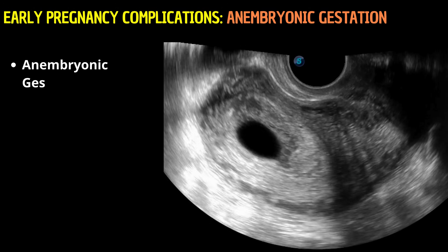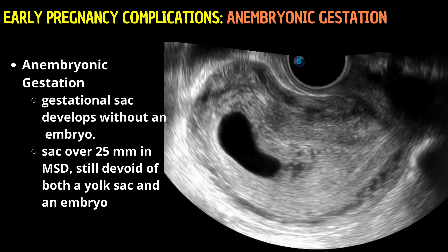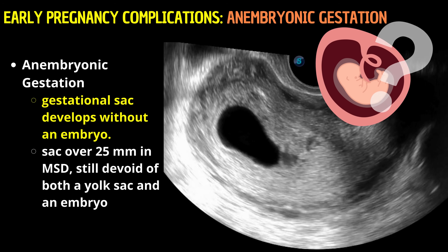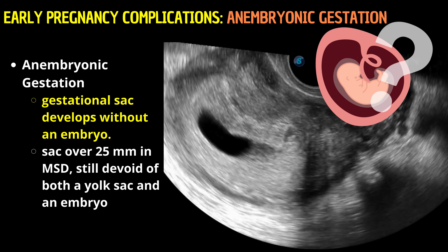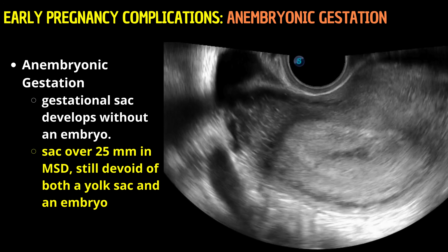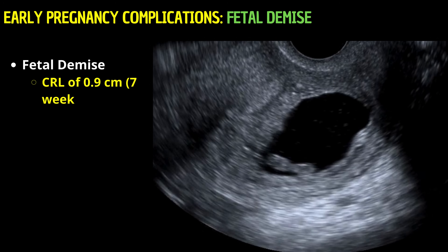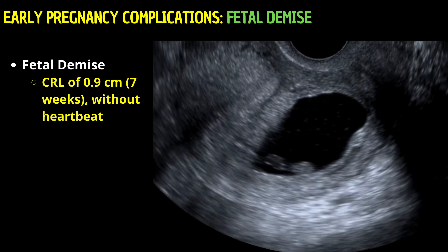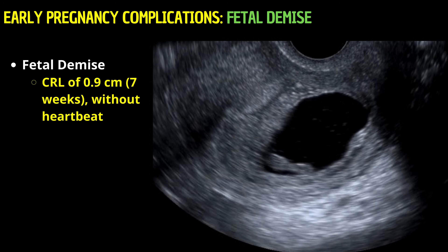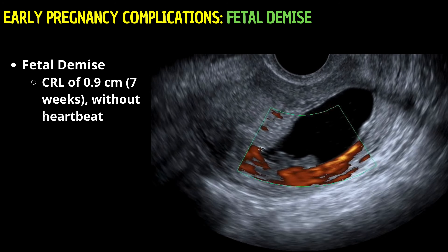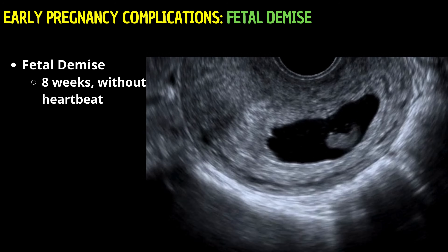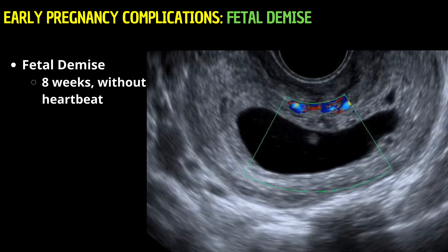In early pregnancy assessments, we sometimes detect the absence of crucial developmental milestones, such as in an anembryonic gestation or blighted ovum. This condition is characterized by the development of a gestational sac without an embryo, identified when a follow-up ultrasound displays a sac exceeding 25 mm in mean sac diameter without a yolk sac or embryo, indicating early pregnancy loss. We might also observe an embryo with a crown-rump length of 0.9 cm, corresponding to approximately 7 weeks of gestation, yet missing the vital heartbeat, signaling fetal demise. Color Doppler is utilized to confirm the absence of cardiac activity by detecting the direction of blood flow. Similarly, the absence of heartbeats in an 8-week gestation embryo underscores color Doppler's role in confirming such findings.